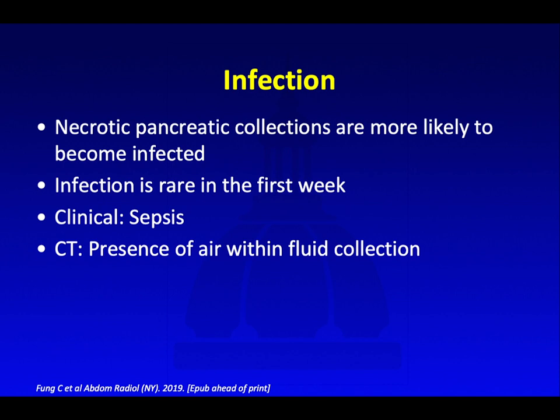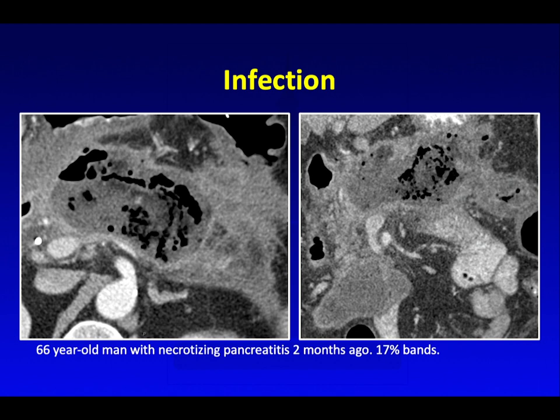Necrotic pancreatic collections are more likely to become infected as opposed to edematous fluid collections, and infection is rare within the first week. Clinically, the patients will present with sepsis. On CT, one of our biggest clues is if we see air within the fluid collection. This is an example of a patient who had necrotizing pancreatitis two months ago, who came in with 17% bands in his blood work. Here we see a very necrotic peripancreatic fluid collection with heterogeneous fluid and soft tissue components, and also a lot of air within this collection. In the absence of any previous instrumentation, we would strongly suspect infection as the culprit.